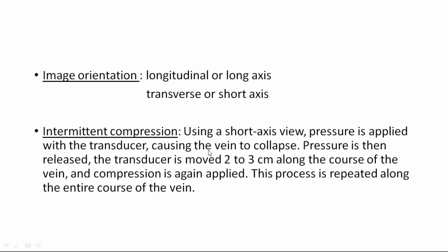Generally, veins will collapse when we apply pressure. So, if any thrombus is present, the vein won't collapse. We have to move the transducer and apply pressure every 2 to 3 centimeters to know the exact location of the thrombus.